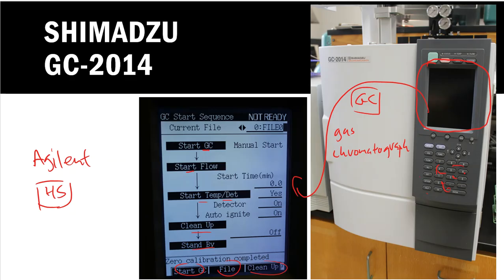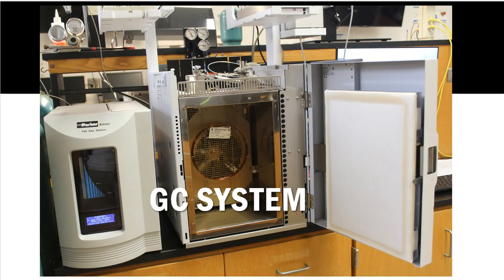All right. So this is actually a door. You can see a handle over here to the left-hand side, and I'm going to put my hand in and open up the door, and on the inside, this is an oven. O-V-E-N, oven. This is where I'm going to bake my cake. Well, actually, no, it's where I'm going to bake the column. And that's actually what it's called. But it's also where separation begins to take place.